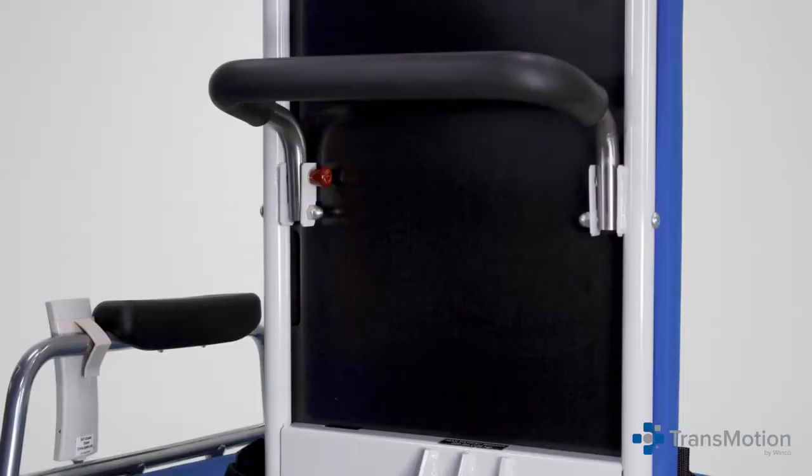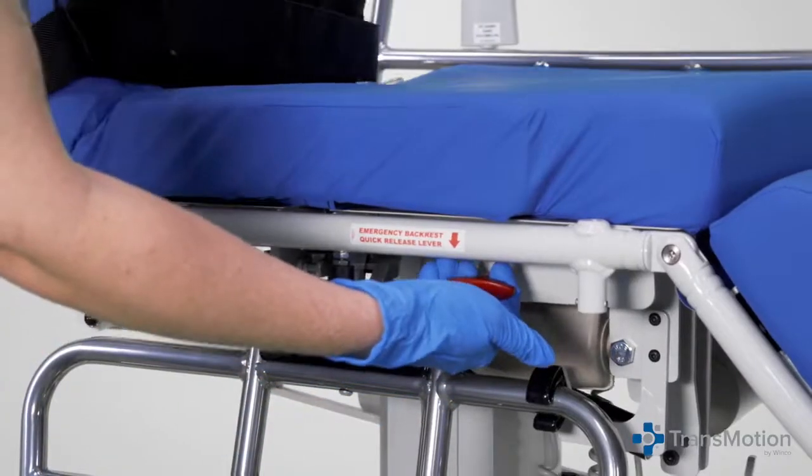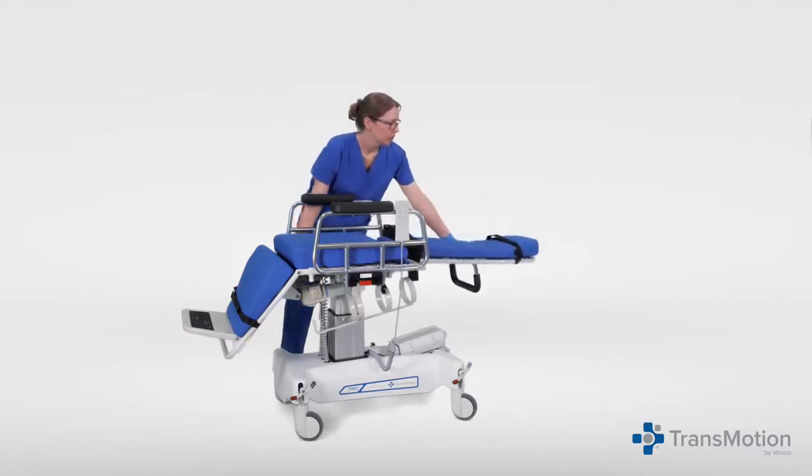The TMM3 chair back is radiolucent for imaging purposes. The manual quick release quickly moves the chair to a stretcher position when emergency situations arise.